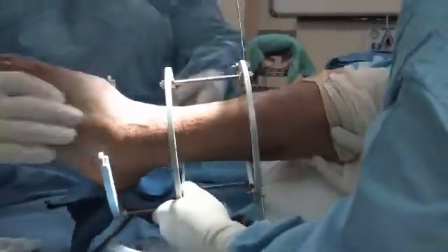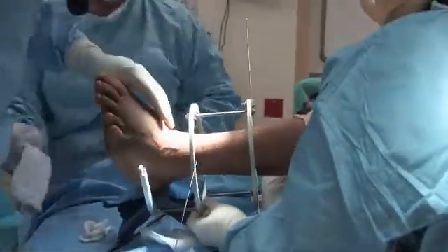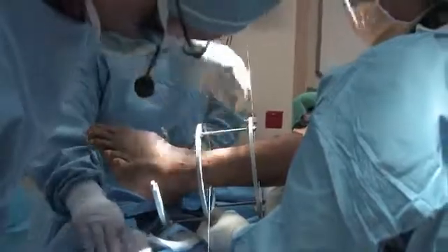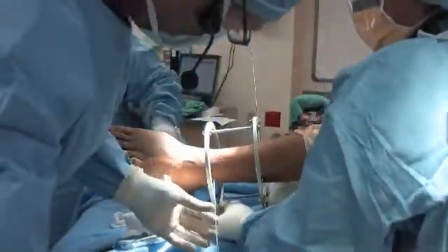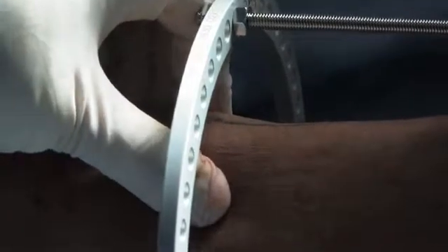Now we'll go ahead and give me a second olive wire. So at this point, we're going to mirror image that pin a little bit distal now on the distal ring. If we internally rotate the knee, that'll put me in a little bit better position. But you can see I'm paralleling my previous wire. These bayonet wires are very, very sharp, and they go through the bone so easily. You want to make sure that you're through tibia and fibula on this.